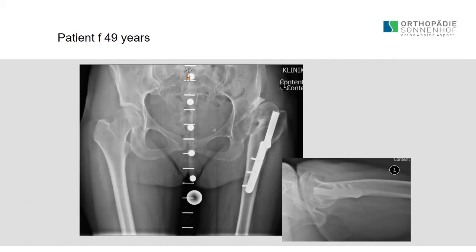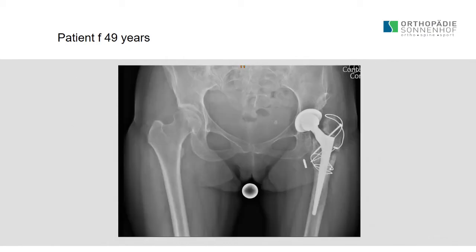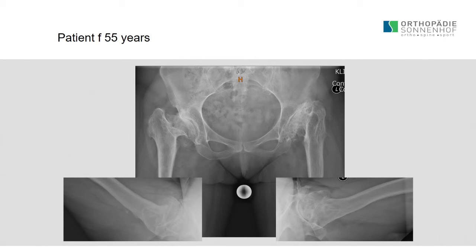This is a very difficult situation in which you have to do an osteotomy, and it will also not be a case where you will use a short stem. This is with shortening in the metaphyseal area. As I already said, this is a very difficult case because it's a completely stiff hip for many, many years, because she has been operated before on both sides.